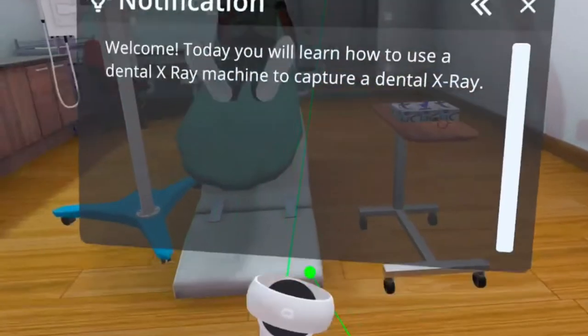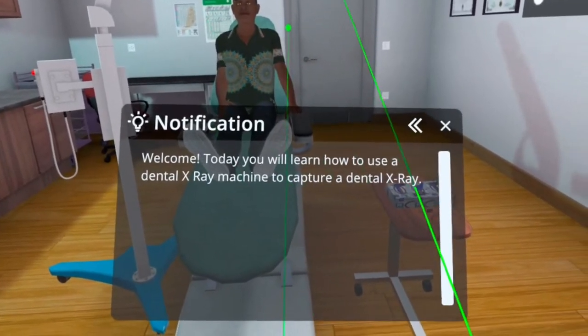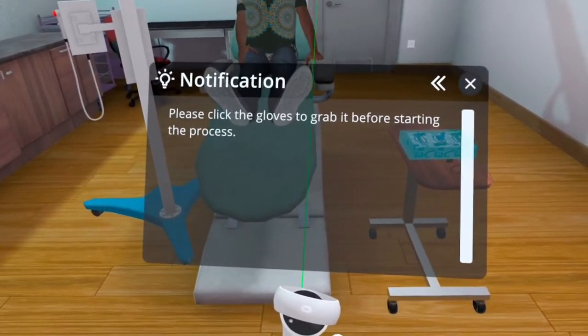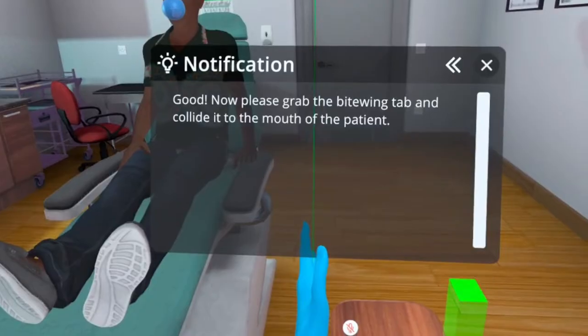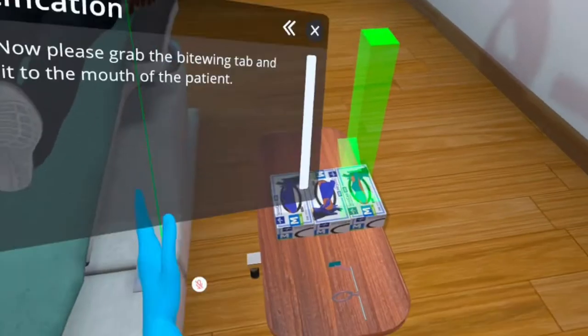Welcome. Today you will learn how to use a dental x-ray machine to capture a dental x-ray. Please click the gloves to grab it before starting the process. Good. Now please grab the bite wing tab and collide it to the mouth of the patient.